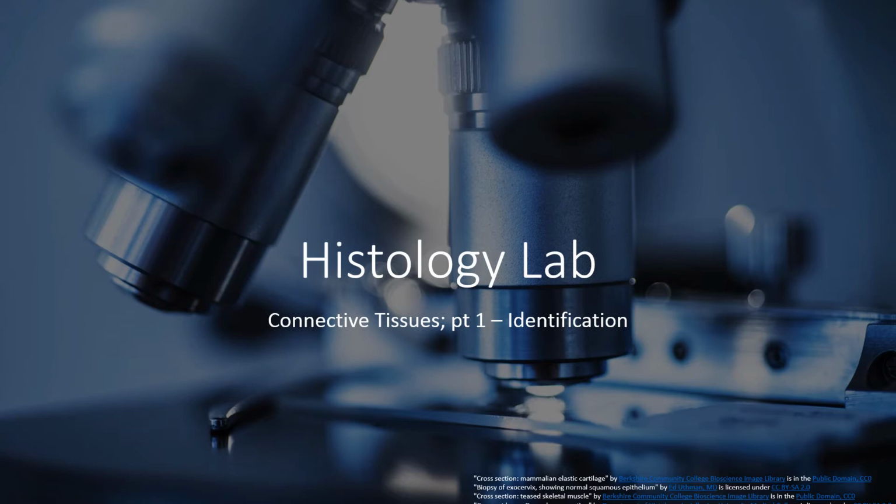In the lecture, we went over quite a few functions, and you'll want to be sure that you remember those for your exam. You'll have to recall them from memory and write them out as a list. For lab, though, our goal is to recognize and name connective tissues correctly when we see them. In this video, we're going to focus on the characteristics of these tissues so that when your lab practical comes around, you should be able to distinguish connective tissues from all of the other tissue types.